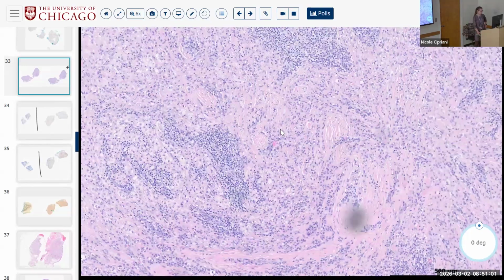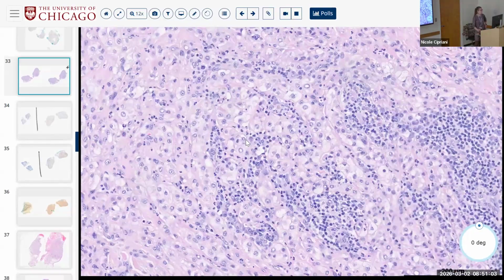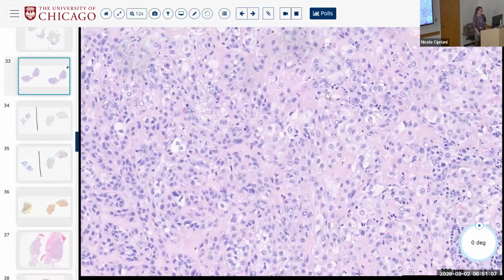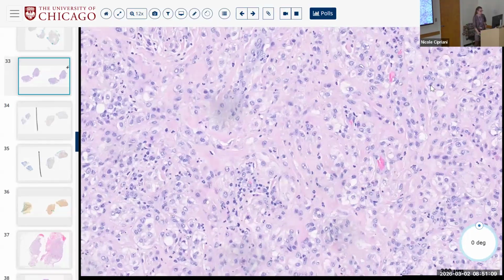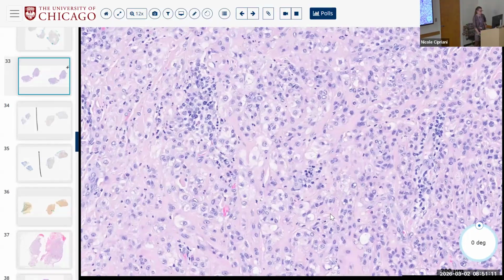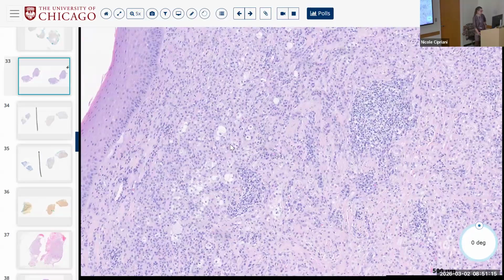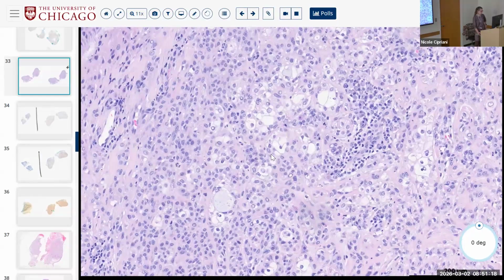This is like some weird solidly growing mucoep. These are actually mucinous cells. Yep. Not really seeing great squamoid cells here. No. I think it's not true. Yeah. Excellent. Right. So you're seeing solid sheets, no structural differentiation, not really any ducts or nests or cribriform.